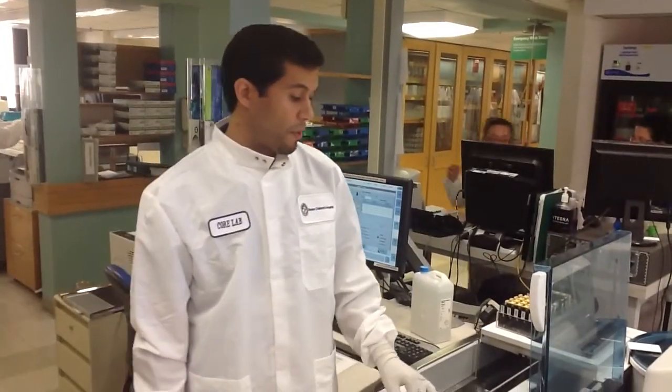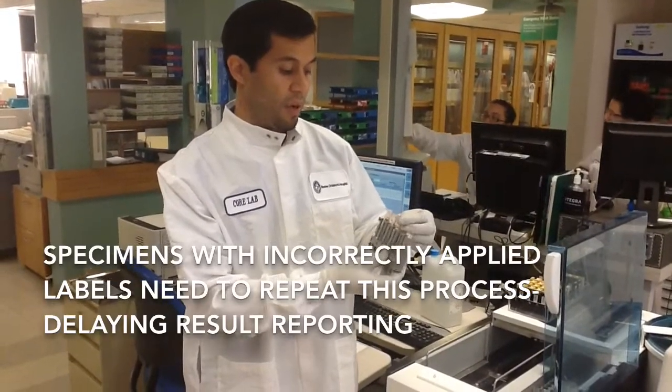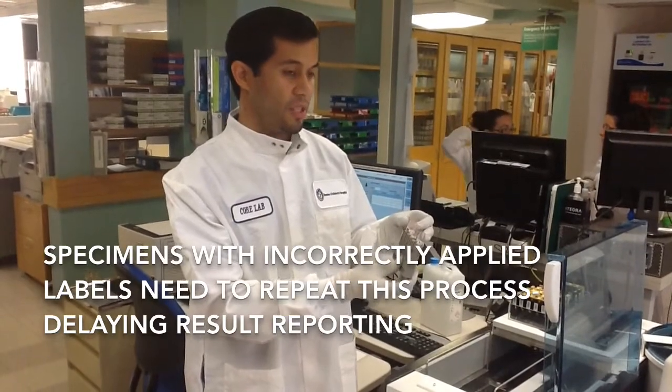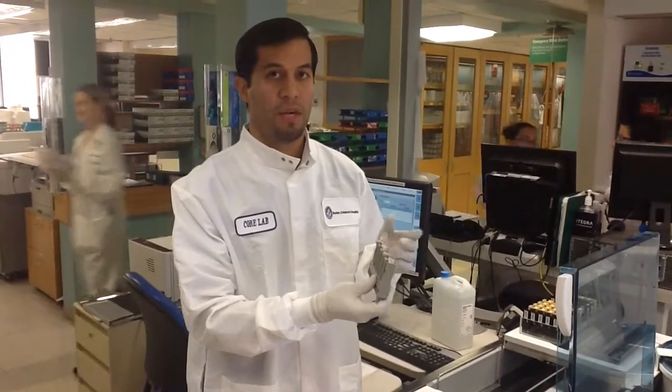Now the processing is completed on the samples placed on the instrument. The correctly labeled sample has been reported. However, the incorrectly labeled samples need to be relabeled and rerun on the instrument, which adds an additional 15 minutes to the turnaround time — doubling the amount of time it would normally take to run the sample.